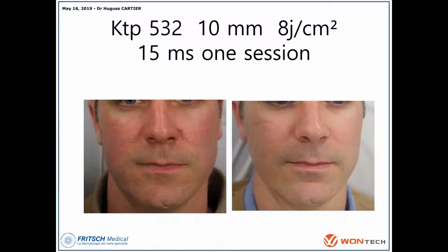For a man, you know, some inflamed skin with rosacea, with a dilated pore size. So you can also maybe reduce at first the vascular redness, vascular disease in one session with a setting, you know, of 15 milliseconds. It could be high for you, but sometimes it's necessary to have more thermal effect as well, to modify the skin structure, to reduce the pore size, to reduce the skin texture. So if you have more thermal effect, you can modify that. And if you proceed with many sessions, it could be better for the patient, even if you always induce some edema during a couple of days.